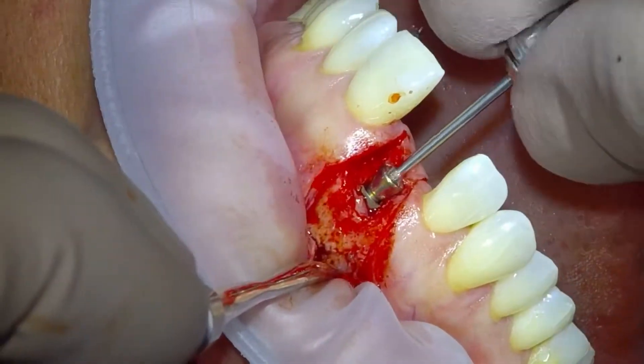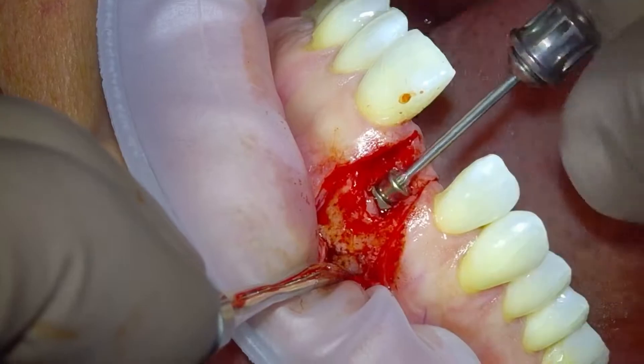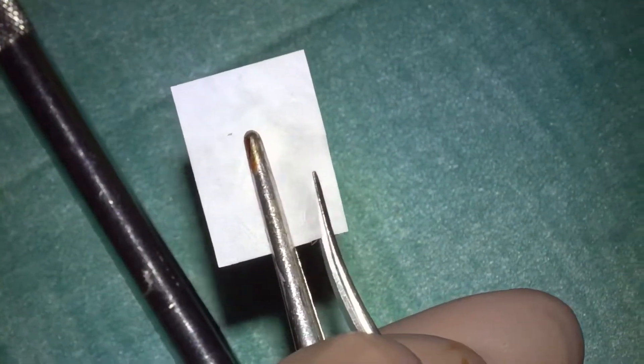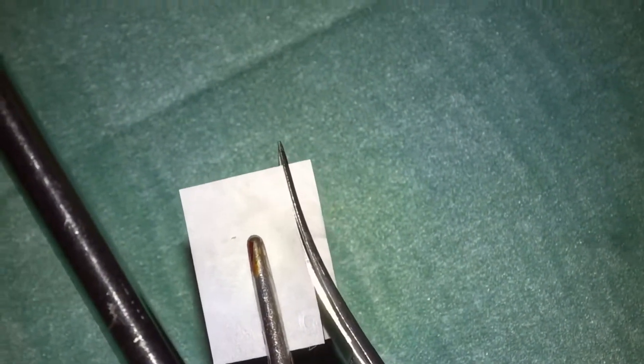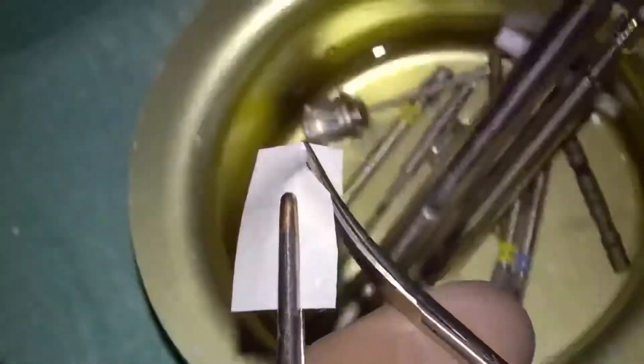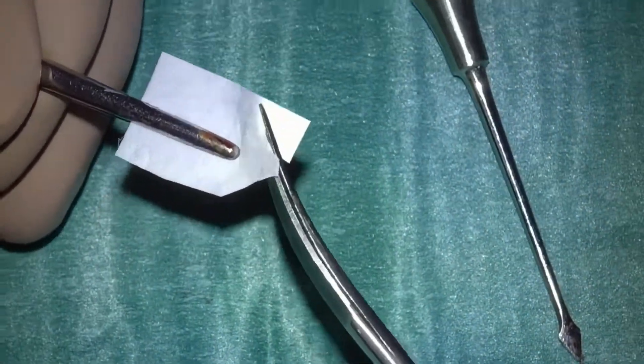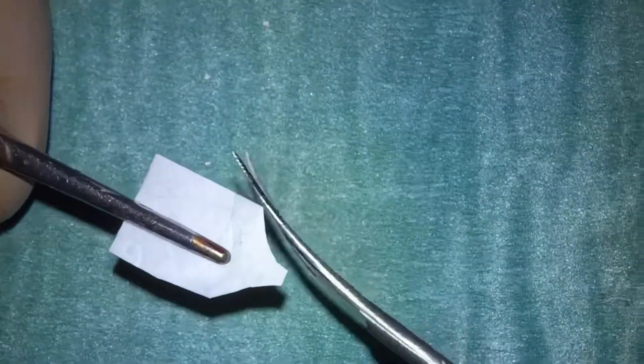Sometimes you can use a 3 or 4mm healing abutment to maintain thickness of tissue as you close over, which is what I've done here. We've got a Jason membrane — we'll just trim that up. You can see it's quite a narrow, flat design. I just like to make a small tag so that I can tuck the Jason membrane in. It's always difficult to make it evenly trimmed when you've got curved scissors.